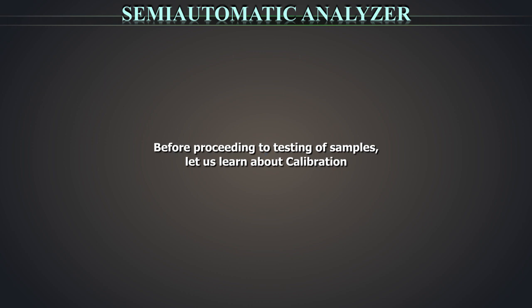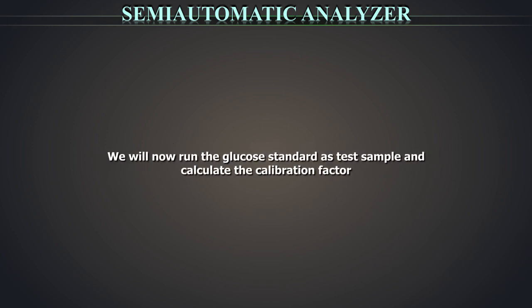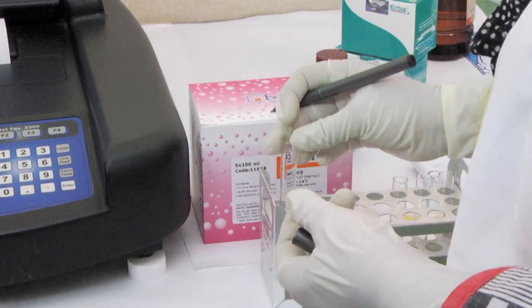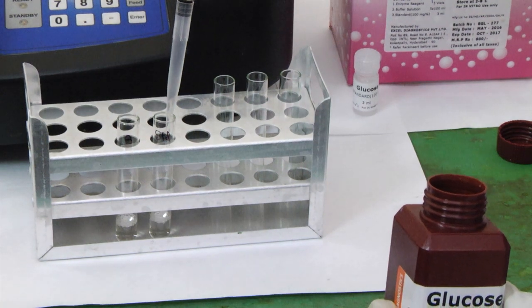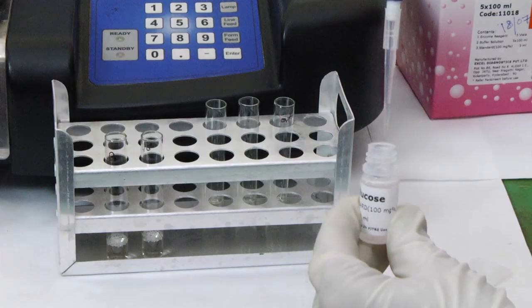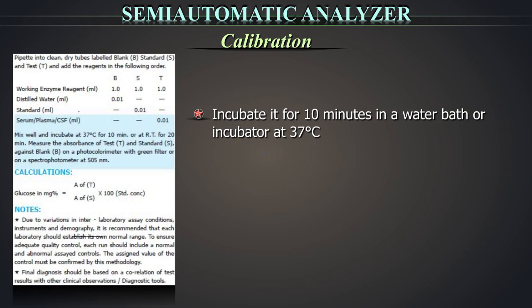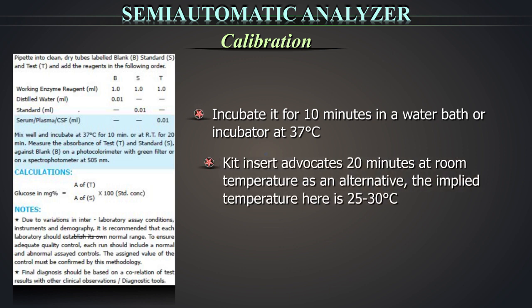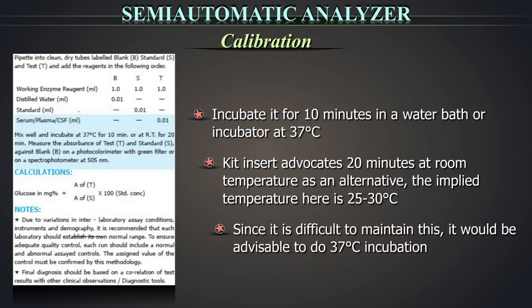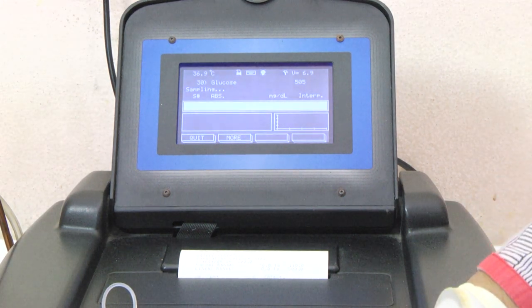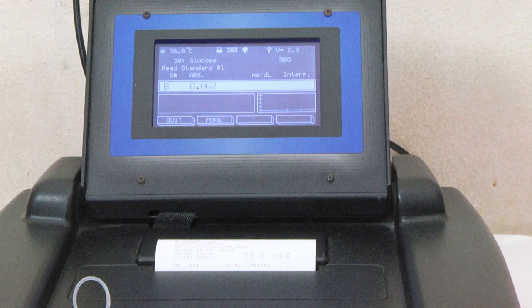Before proceeding to testing of samples, let us learn about calibration. We will now run the glucose standard as test sample and calculate the calibration factor. Label two test tubes as standard and blank. Take 1 ml of working reagent in both test tubes. Take 10 µl of standard with a pipette, wipe off the excess with a tissue and add it to the standard test tube. Incubate it for 10 minutes in a water bath or incubator at 37 degrees. Aspirate the blank test tube, i.e. the one without the standard, and read the absorbance. Here it is 0.062.